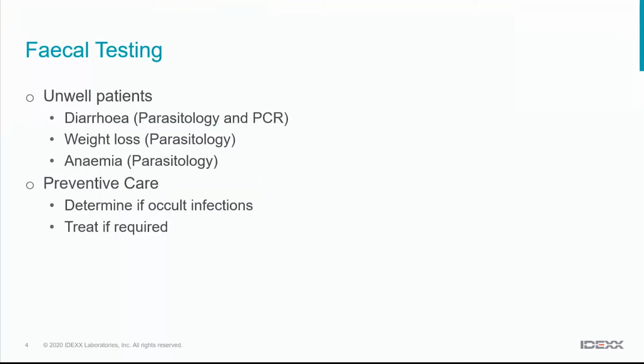We sometimes also use fecal parasitology in healthy patients. So doing routine checking to see if there are fecal parasites present, and sometimes patients can have occult infections. So they may have an infection without clinical signs.